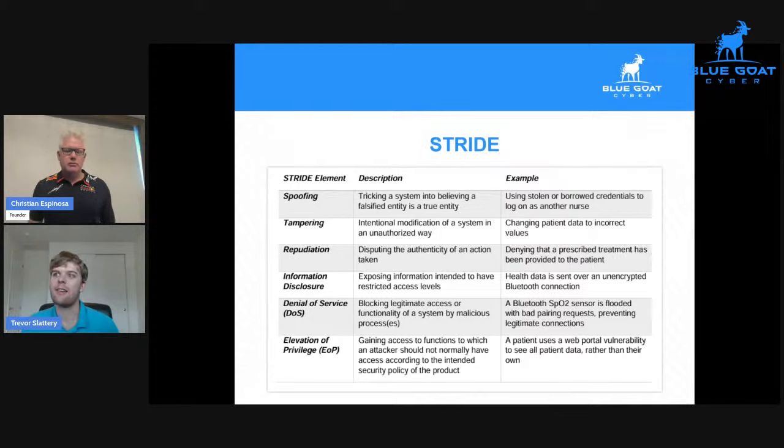You could say that someone has a disease that they don't actually have, and they could potentially receive a dangerous treatment. Or you could say that they don't have a disease they do have, and then they would miss out on life-saving care.